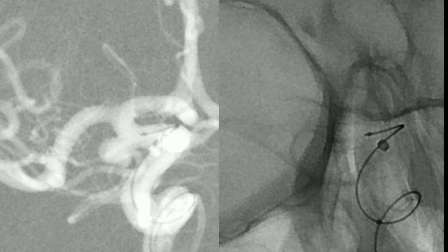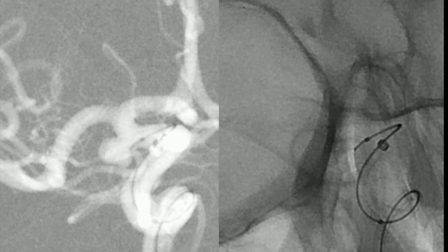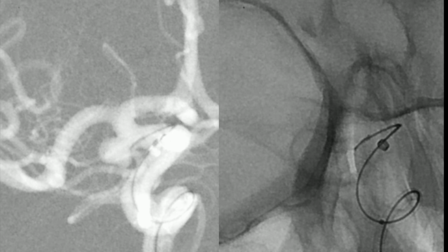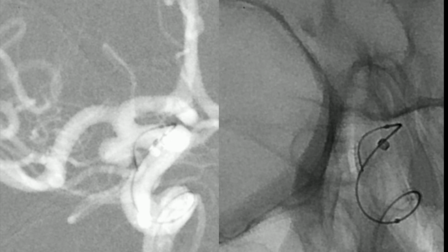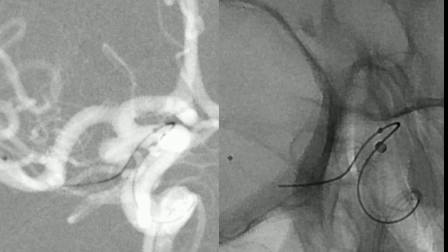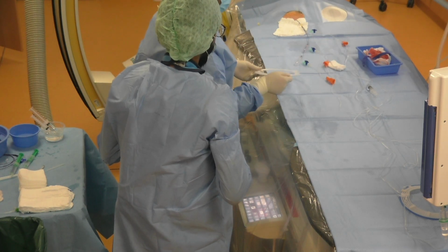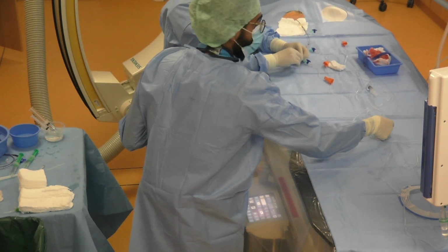We should be very careful here. And this is here the aneurysm. We're almost about to navigate the PCOM. And now we are inside the PCOM. We push the microcatheter distally in the PCOM and pull the microwire back. And this is here the microstent, Pegasus HPC coated.